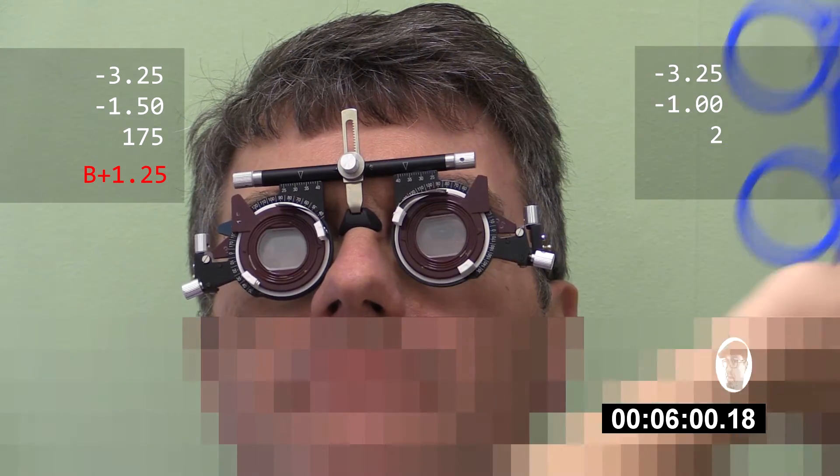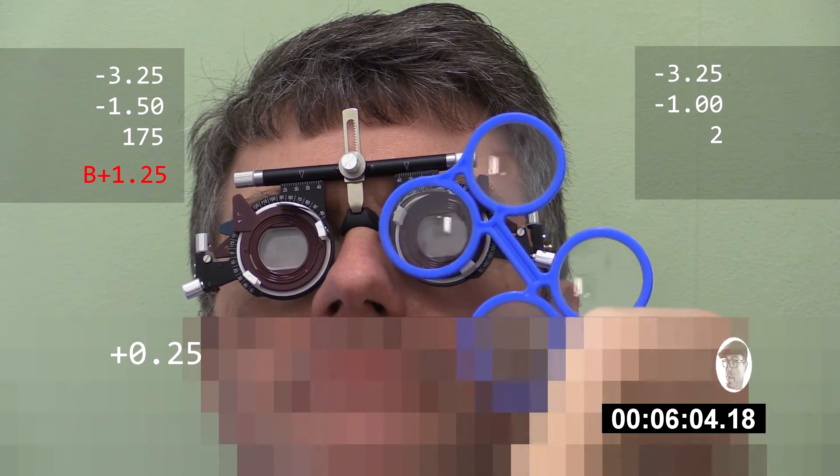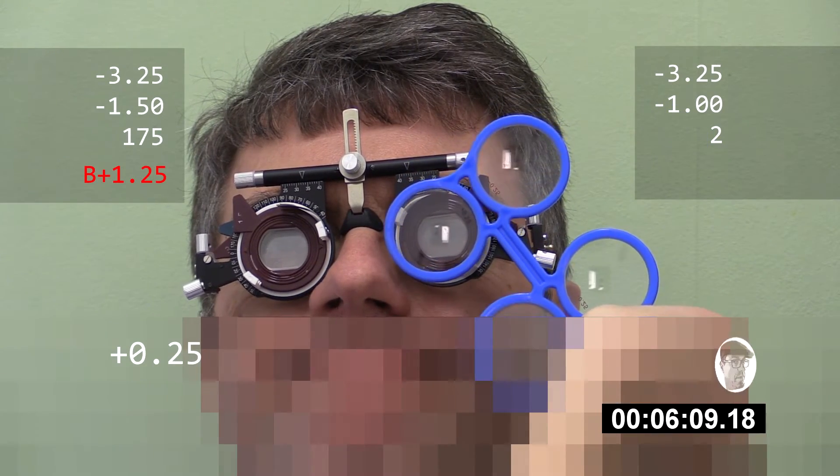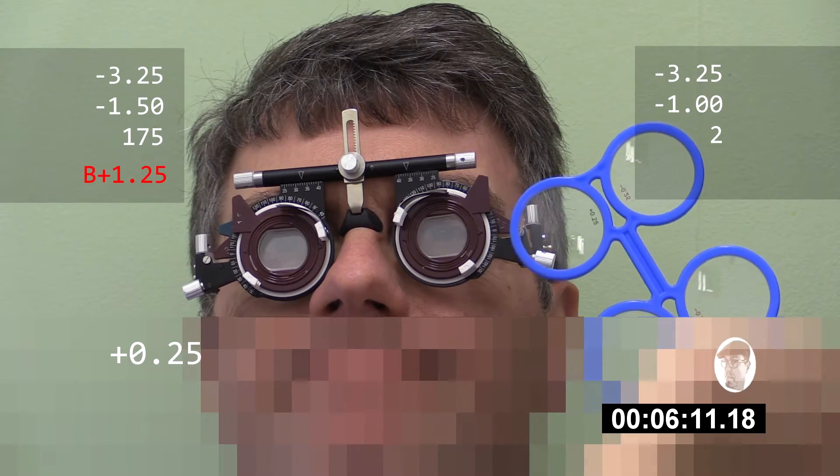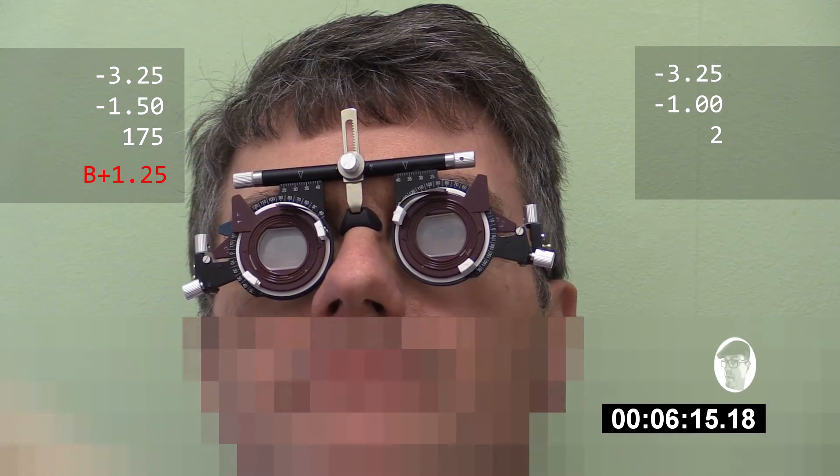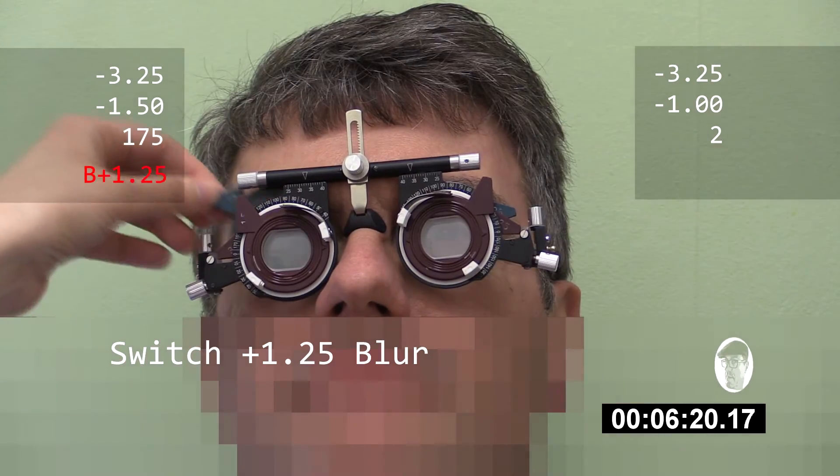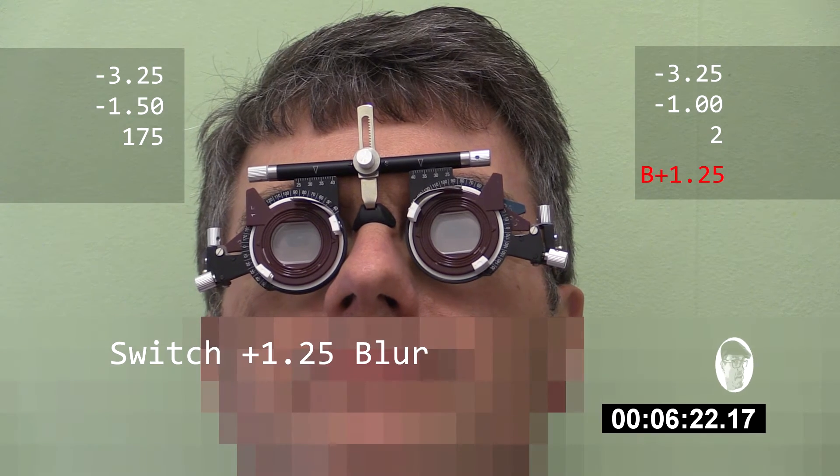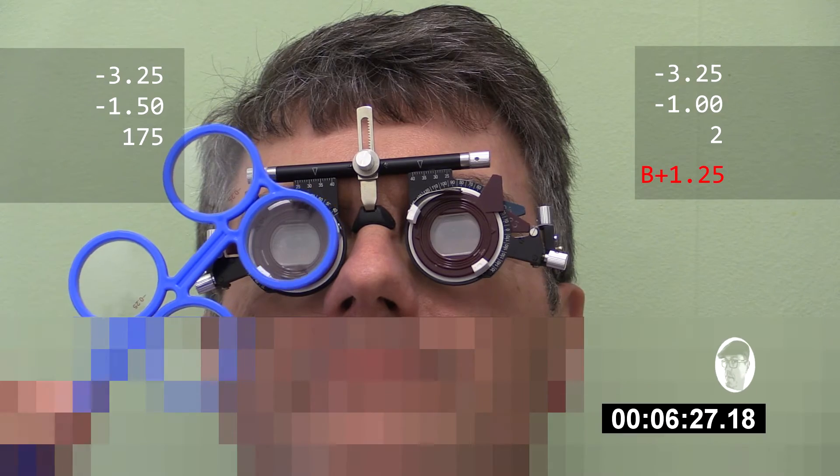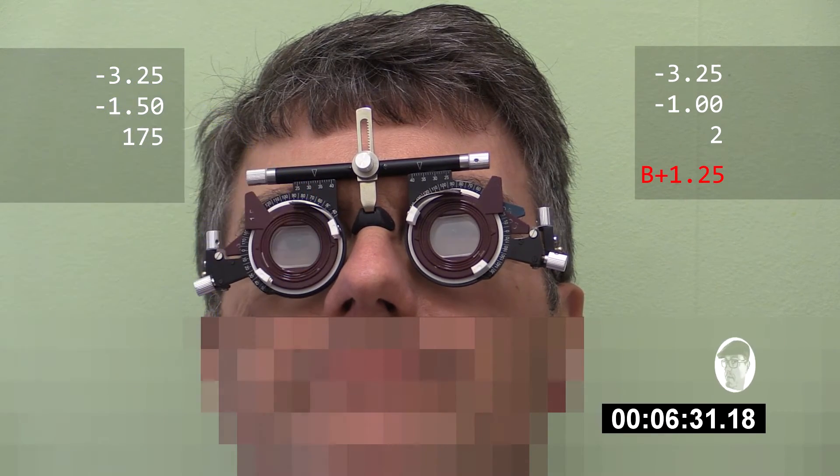I'm going to make smaller changes here. Is it any clear with that lens, the same, or without? I'm seeing it in. With, the same, or without. Without. Without. Now in there. Take it out of that side, again looking at the smallest that you can. Is it any clear with that lens, the same, or without? Without. Probably the same, I reckon. About the same there.